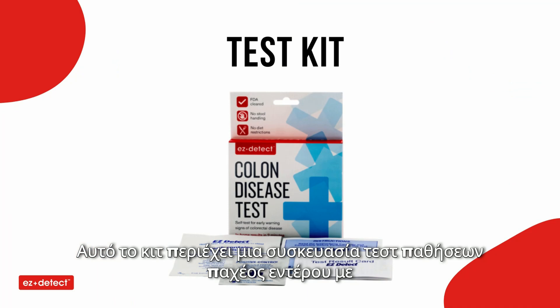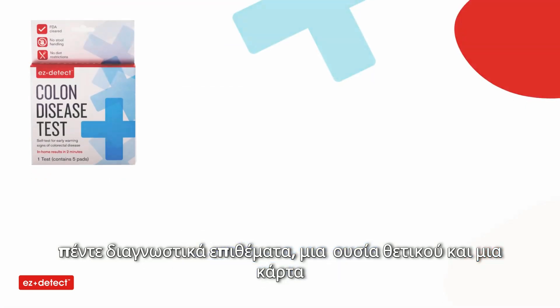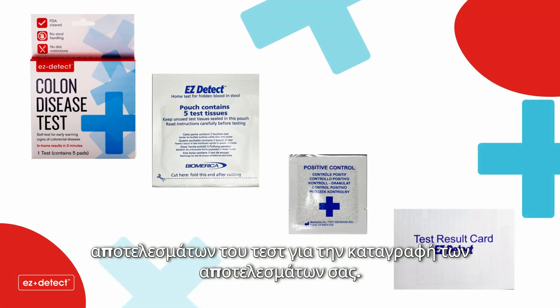This kit contains a colon disease test pouch with five test pads, a positive control substance, and a test result card to record your results.